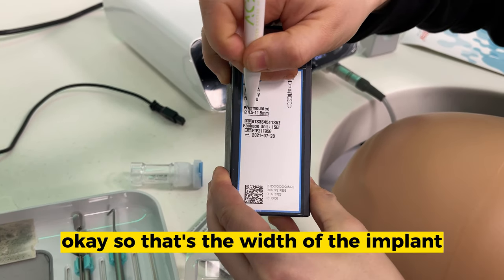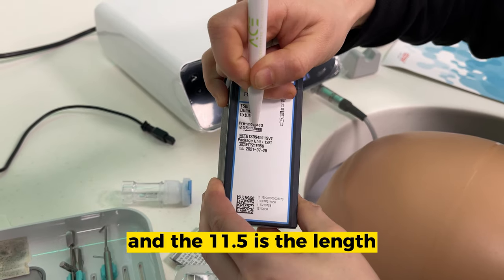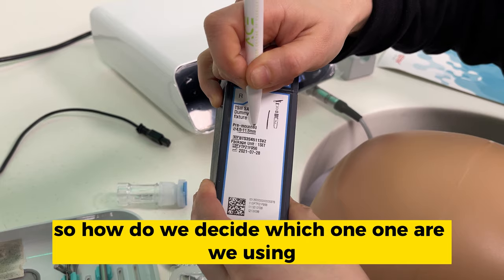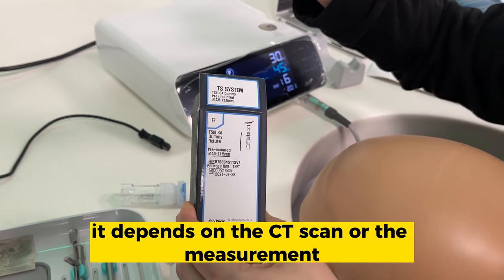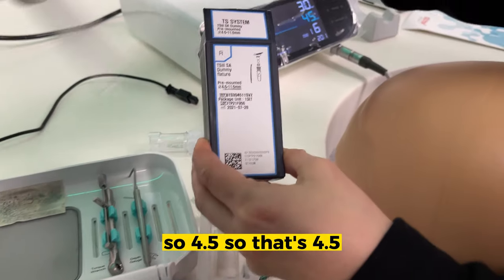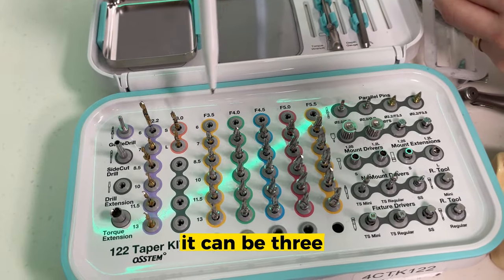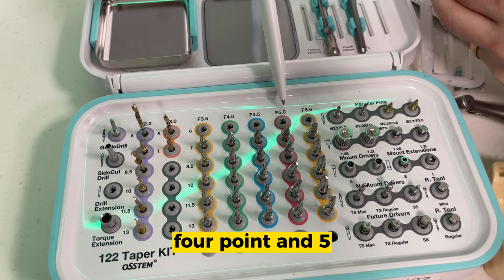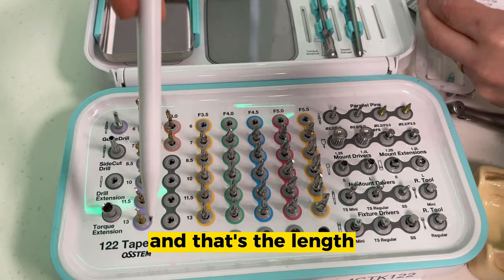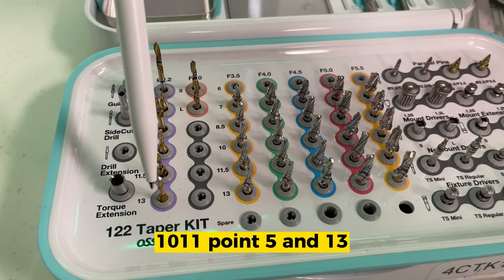Okay, so that's the width of the implant, 4.5. And the 11.5 is the length. So how do we decide which one we are using? It depends on the CT scan or all the measurements that are going to be done during the consultation. The width is not always 4.5. It can be 3, 3.5, 4, 4.5. And the length can be 6, 7, 8.5, 10, 11.5, and 13.